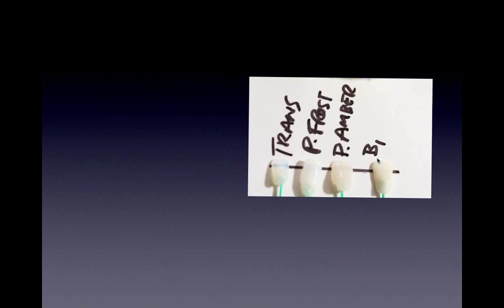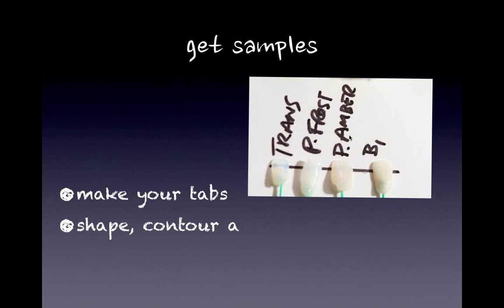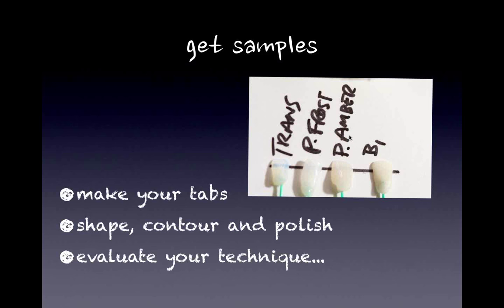So one of my suggestions is you take your material, whatever you feel you'd like to do, and get your own samples. Whatever composite you're using, make your own samples. Look at the different colors. This is ours from Translucent, Pearl Frost, Pearl Amber, and B1 from UltraDent. And it gives you a different shape and a contour. You polish it so you really can see what you can do with your composites. I think that's the best way to do it. A lot of companies promise a lot of things, and it's really hard to evaluate. So I kind of make my own. I polish it to make sure that I have the right color when I'm choosing the right color.